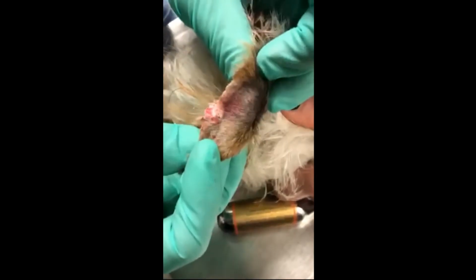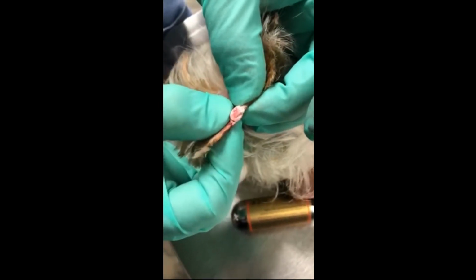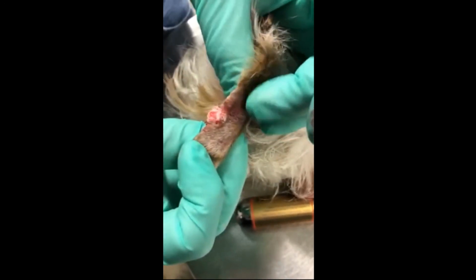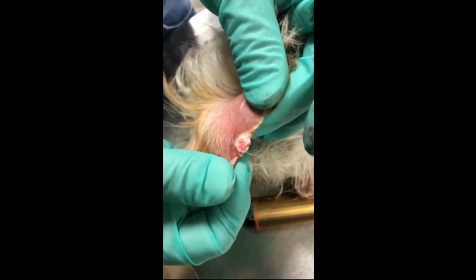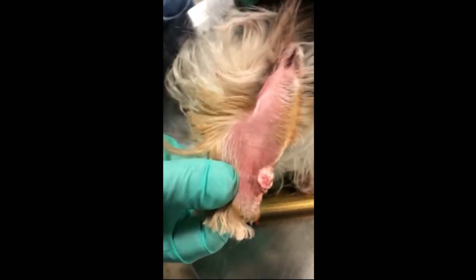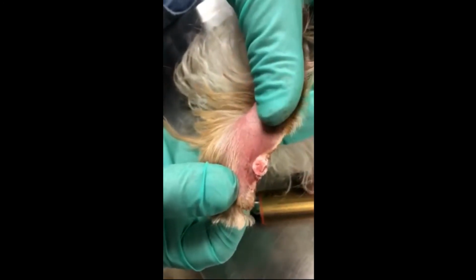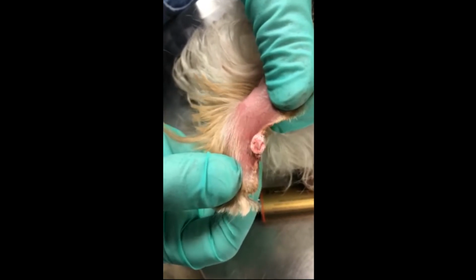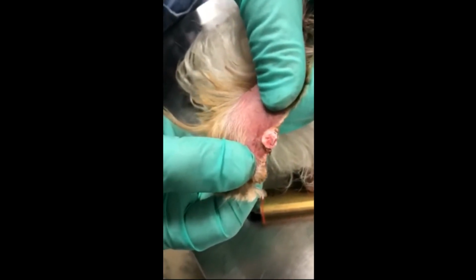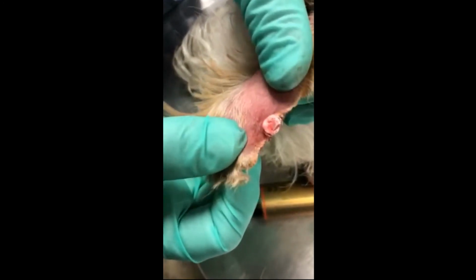Post freeze cycle, it'll probably take in this particular ear about 2 minutes to thaw. We sometimes see some serous oozing and on a rare occasion some bleeding. I have clients just utilize a little styptic to prevent any bleeding in the house. And of course I've trimmed off some of the long hair so that during the necrosis cycle we don't get adhesion of hair on top of the mass. We'll see it in 3 weeks, and if it's completely gone in this particular ear, there'll be a defect in the pinna margin, but it shouldn't be unsightly once the hair's grown back in.